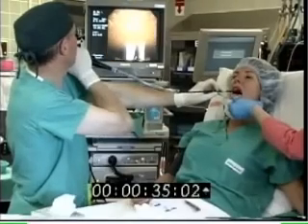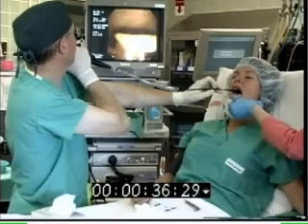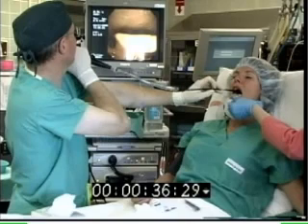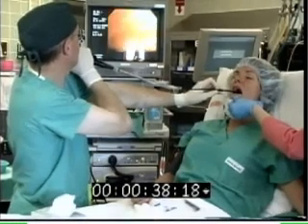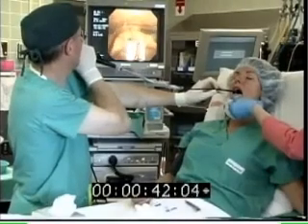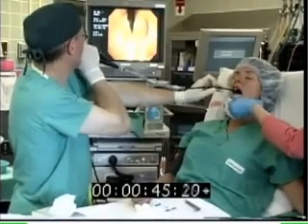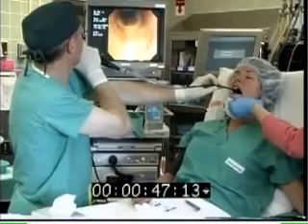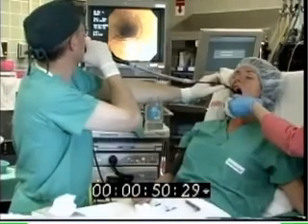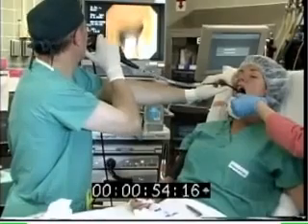The scope is advanced past the uvula and flexed carefully to visualize the epiglottis. If the epiglottis is oriented posteriorly or is in contact with the posterior pharyngeal wall, the patient can be instructed to take a deep breath and thereby move the epiglottis anteriorly. The scope is then passed posterior to the epiglottis to visualize the vocal cords. If the bronchoscope is off midline at the level of the epiglottis, the approach to the larynx can be much more difficult. The scope is then advanced in the midline through the glottis and positioned proximal to the carina. As the scope is advanced through the larynx, the patient is again instructed to take a deep breath to maximally abduct the vocal cords and thereby facilitate passage of the scope.